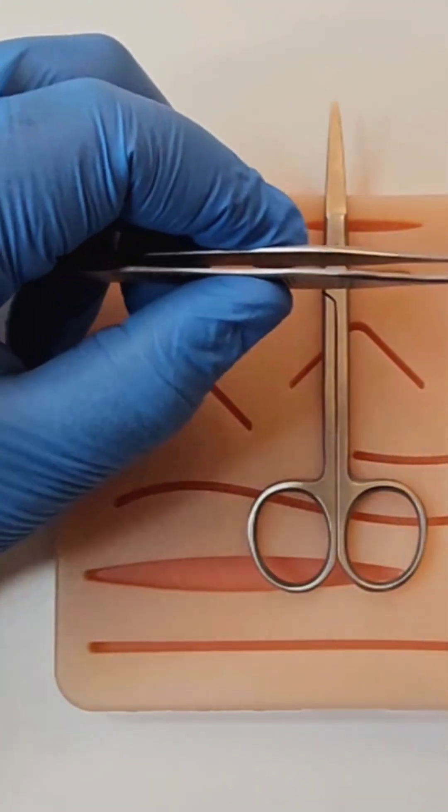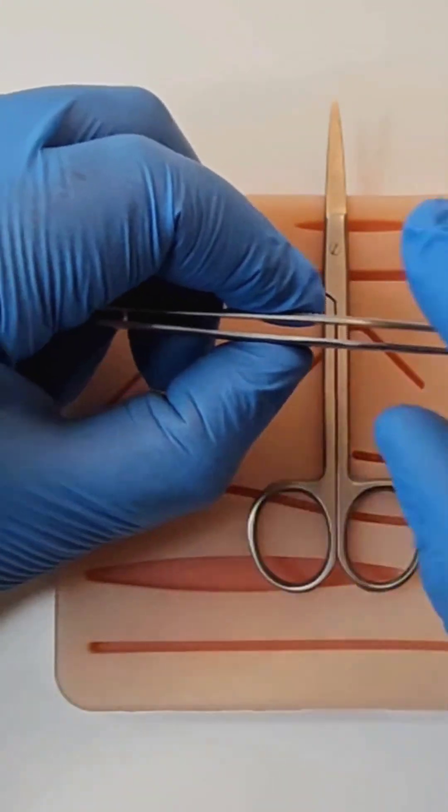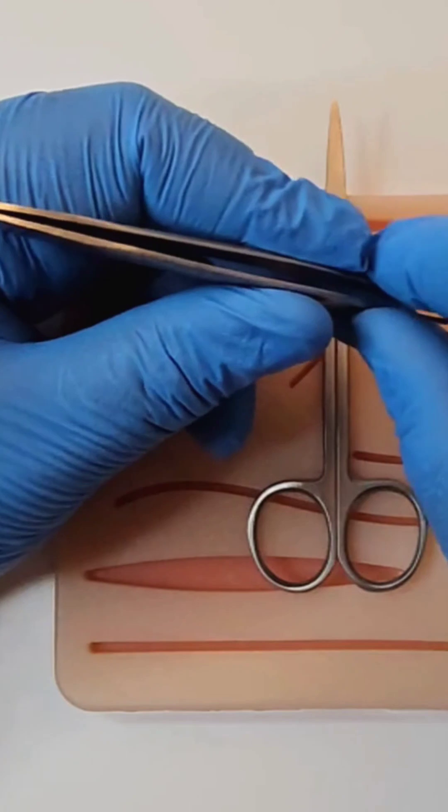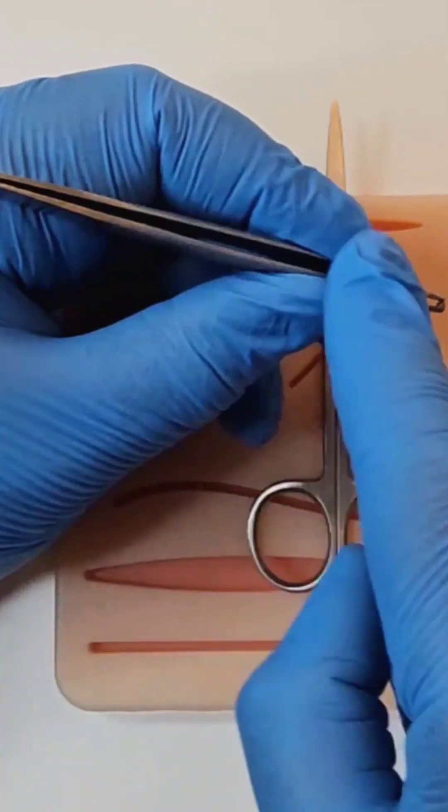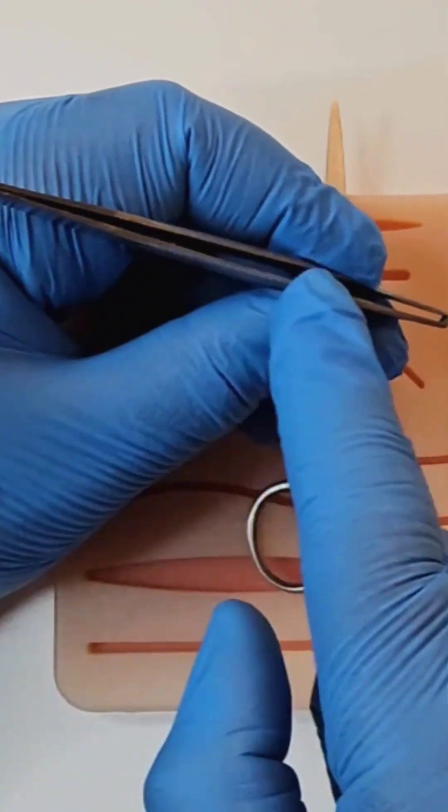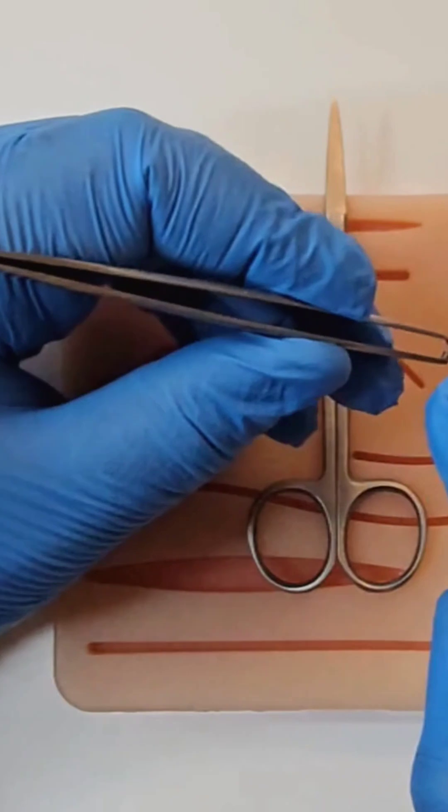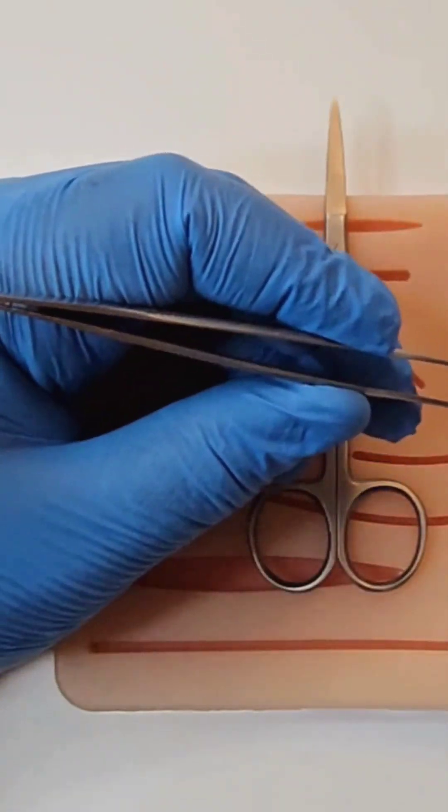We're not tweezing eyebrows, therefore the forceps doesn't sit under. We need control and precision. Try like this with the body of the forceps above your index finger. Little finger can be used for stability.